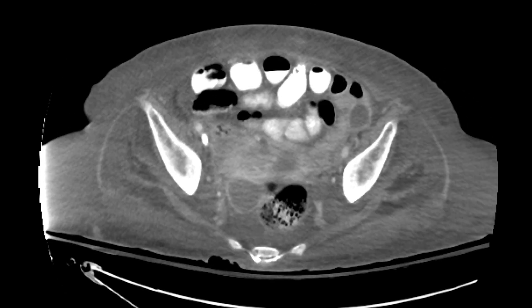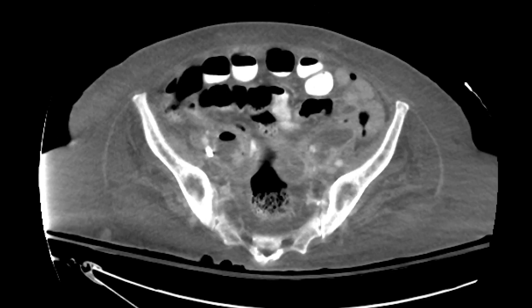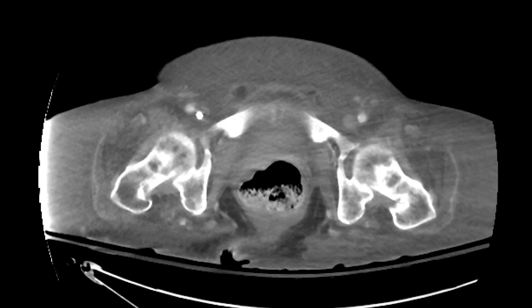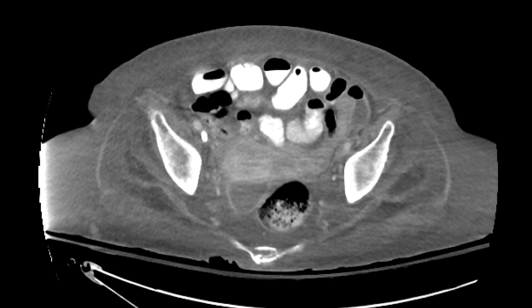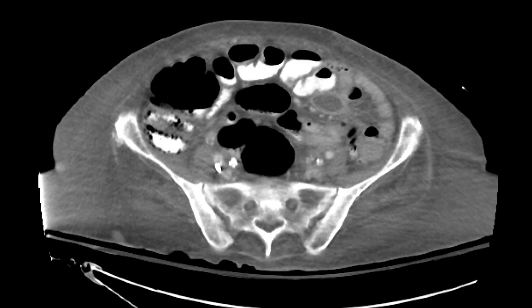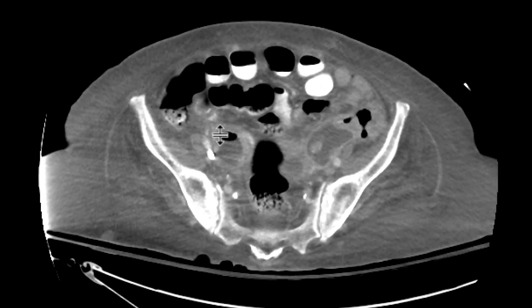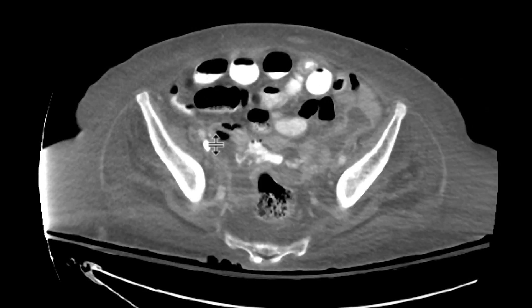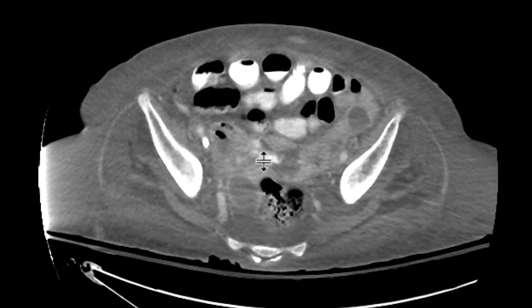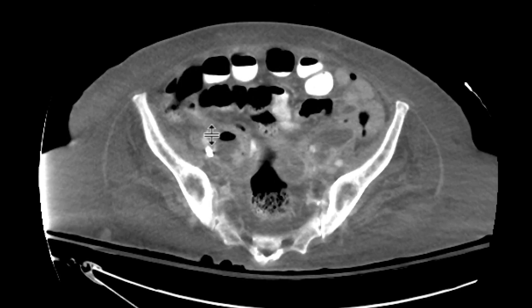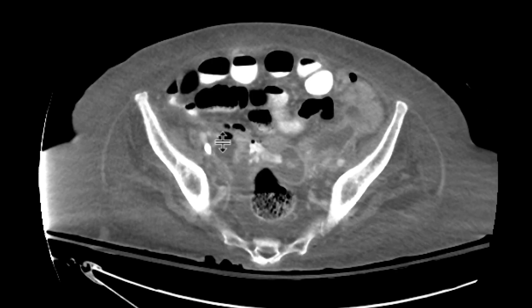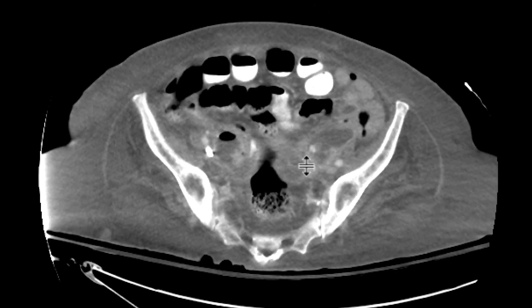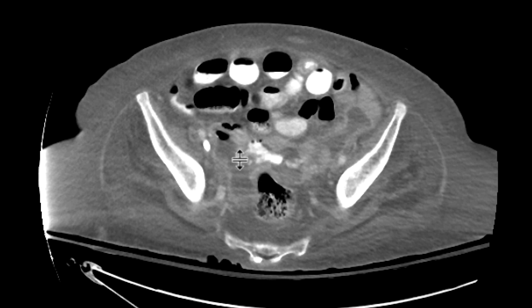We need to figure out why this patient has all these abscesses and pneumatosis. Whenever I see abscesses in the pelvis, I want to make sure I look at the appendix. In this case, you can see the cecum here; the appendix comes out at the base of the cecum. Following it, it has some oral contrast in it, and you can see it continues on and empties into this abscess.